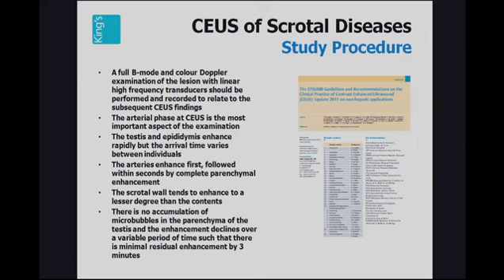You need a higher dose than you would normally use in the liver. Those of you who are familiar with the drug that is predominantly used in Europe, SonoVue, will know that for liver lesions you are injecting a dose of 2.4 mils, but for the testes you would need to inject 4.8 mils to get adequate visualization. This is not of concern. The initial dose-finding studies indicated that the appropriate safe dose was 4.8 mils.